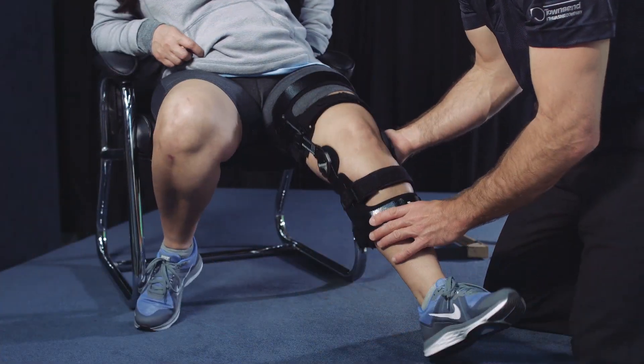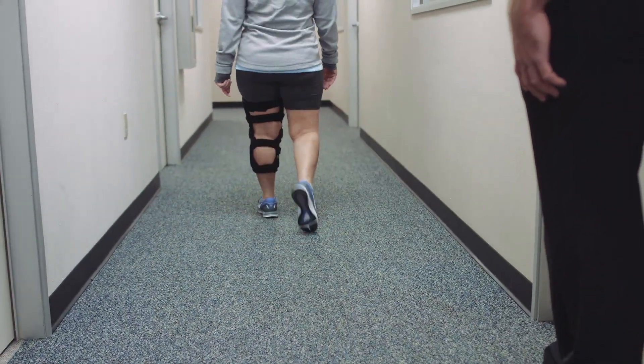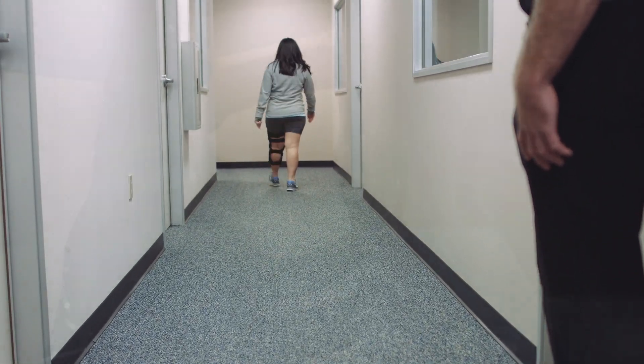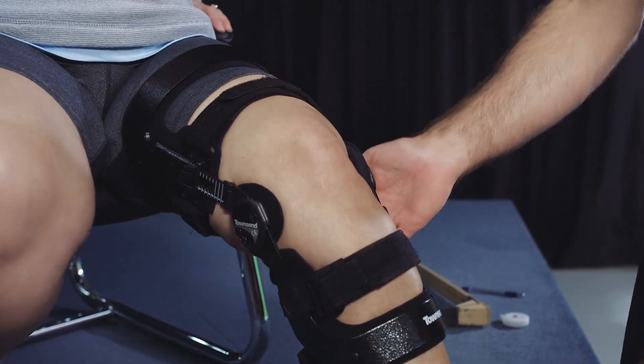At this stage, you have corrected the patient's knee to their neutral position. Before adding more correction, have the patient ambulate and describe whether they feel a corrective change generated from the brace. Some patients will be satisfied with this initial level of correction, but additional correction may be needed.